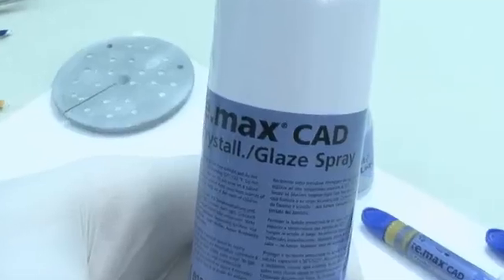Once all shading and staining is complete, glaze spray can be applied. It is important to shake the IPS e.max CAD glaze spray vigorously prior to use. This will ensure an even mix of contents and consistent application of glaze.